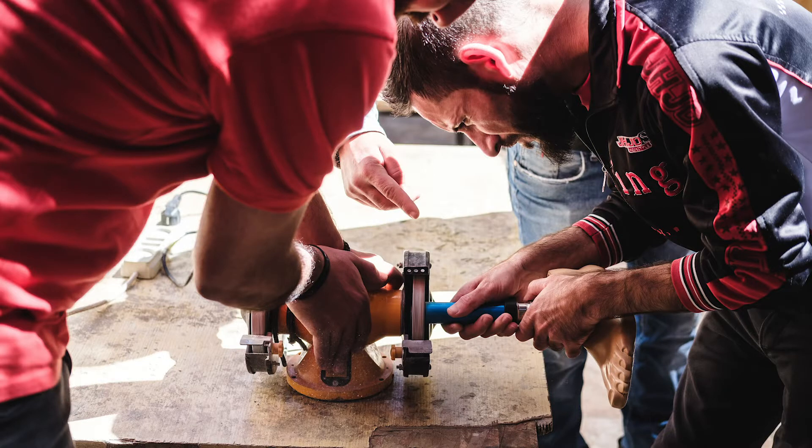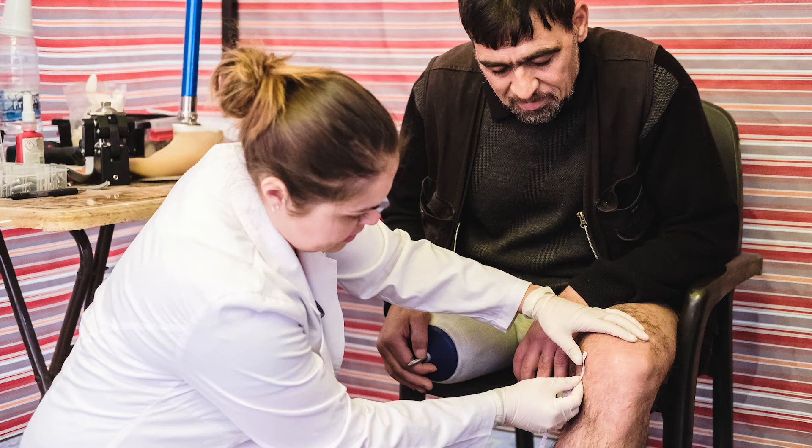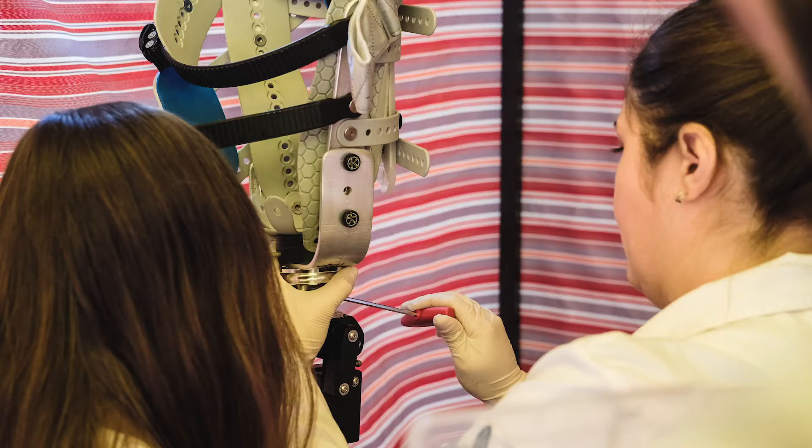We had several men who were Iraqi, Syrian, and Jordanian helping us. I would have them help assemble the socket and make adjustments, and they were saying, I could do this. I was making the point that yes, this type of technology anyone can do with a little training. It can provide employment, but it can also give these people a way to make an impact on their own people.